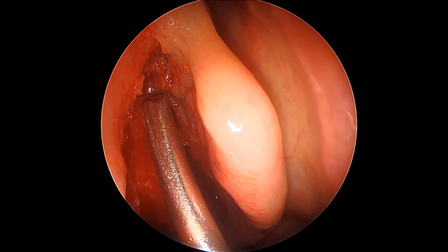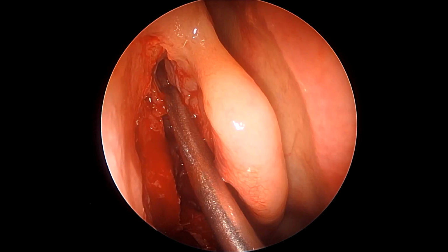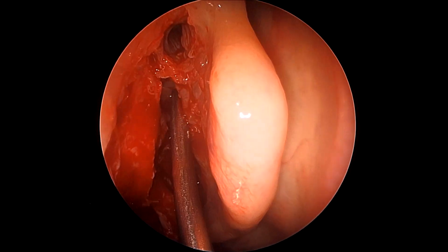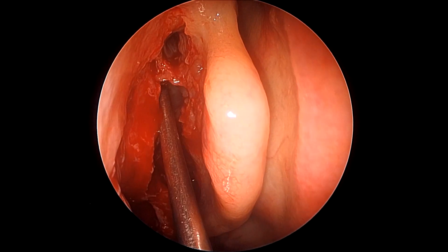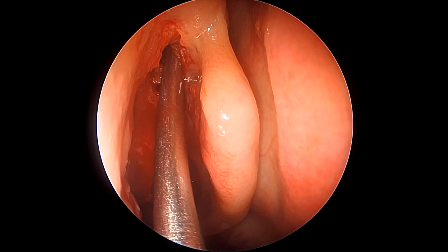This again is the region of the cells of the frontal recess. Could be type 1, 2, 3 configuration, and which has to be broken using cell-by-cell dissection, either using a straight curette or a suction curette.